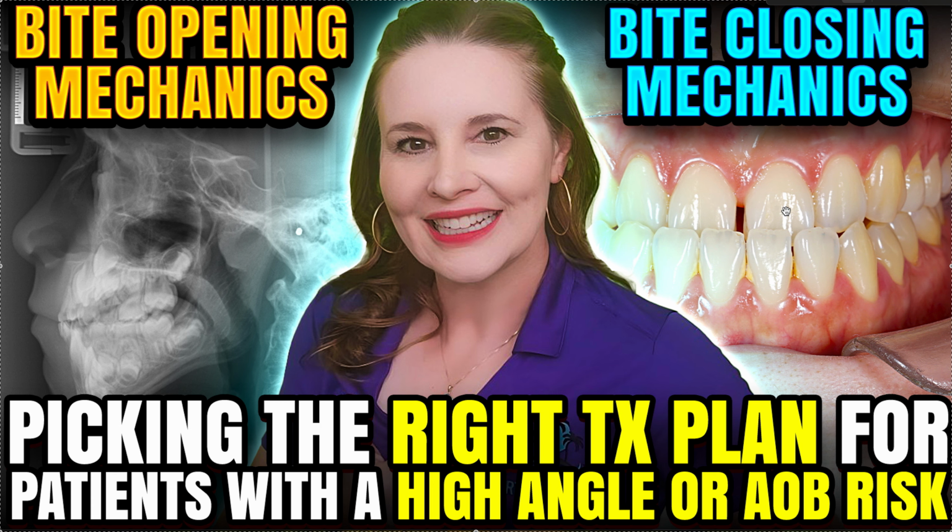Actually, Invisalign in general will help close a bite a little bit because it covers the teeth and it prevents extrusion. That's why we often see POBs, or posterior open bites, in the back, because it actually has a bite closing effect. In terms of expansion, we talked about expanders opening a bite. Well, the Invisalign palatal expander helps to close a bite. Why? Because it covers the tops of the teeth. Same thing if you did a bonded expander, one that had acrylic coverage. I don't like that. It causes all kinds of decay because you can't take it out, but it could potentially help to close a bite while you do expansion.